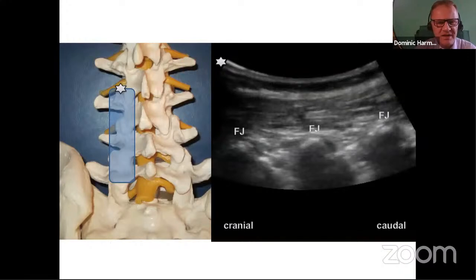So here's an ultrasound image. It's a longitudinal scan. Now, I wouldn't often use this type of approach in terms of injections, but what you're seeing here is the skin from the top and down here. Now you can see bone, and in fact, you can see the facet joints here. You can use this type of scan to tell the depth, the level you're at from L5. I most commonly would look down here at the sacroiliac joint, L5, S1, and count upwards that way. But this is another way of counting upwards.